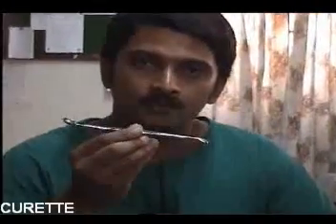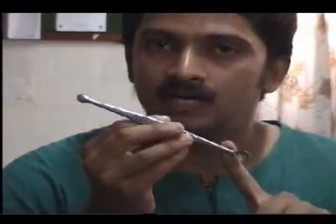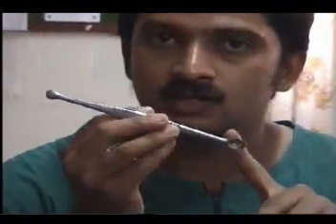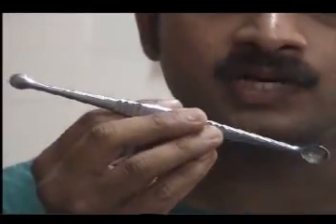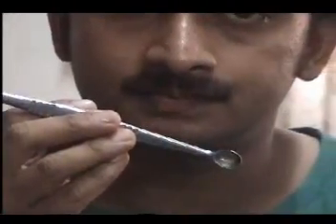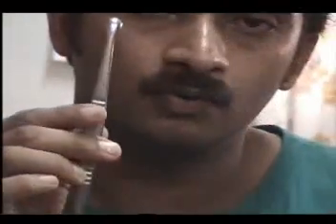This is the curette. It is simply shaped like a spoon on either side — one size at one end and another size at the other. The curette is used to clean the end of the bone, either in infected cases or in cases where soft tissues are obstructing your fracture reduction. This is the last of the instruments used directly on the bone.